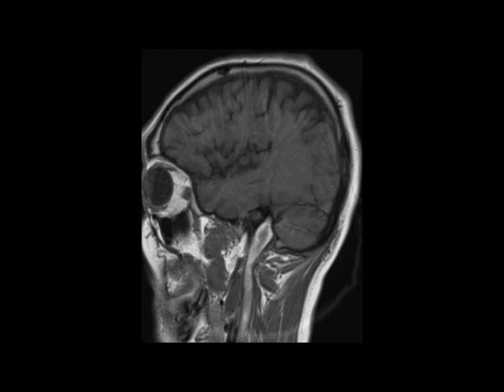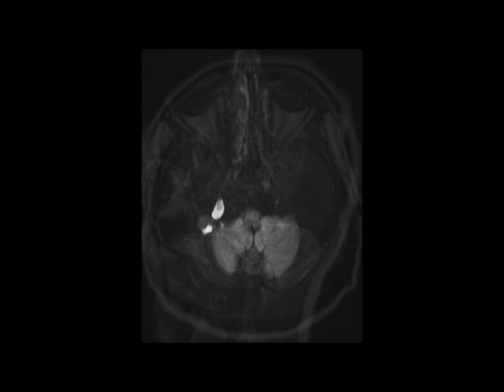The second image with FLAIR weighting demonstrates increased FLAIR signal hyperintensity in the right transverse sinus. The sagittal T1-weighted sequence off midline demonstrates hyperintense signal compatible with thrombus extending from the right jugular bulb more inferiorly.